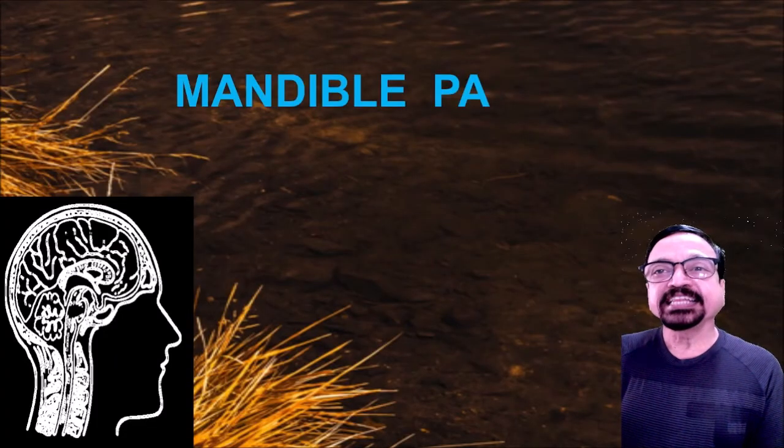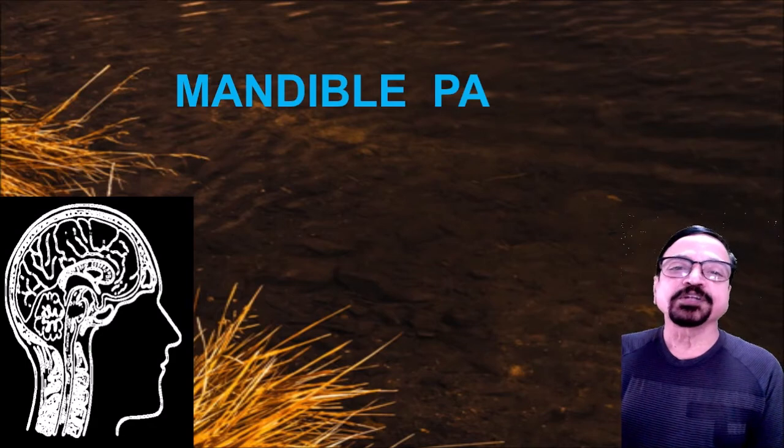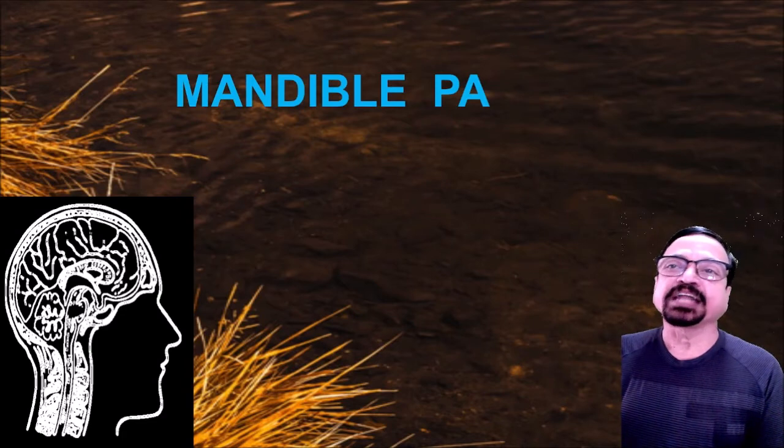Now we will see the mandible PA. Why don't we take the mandible AP? Because the mandible is an anterior structure, and the thumb rule or basic principle of radiology is that the part which is pathological, the part which we want to radiograph, has to be close to the cassette. So that is a basic principle of radiography. So here we make the patient prone and we see that the mandible touches the table.